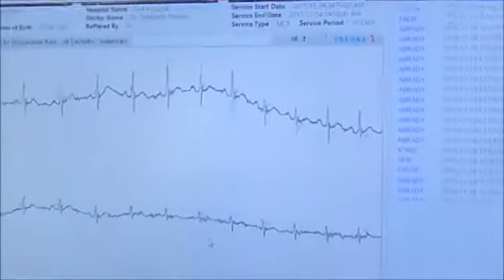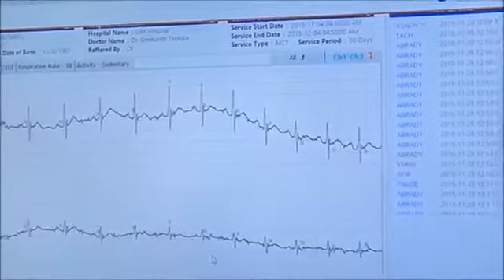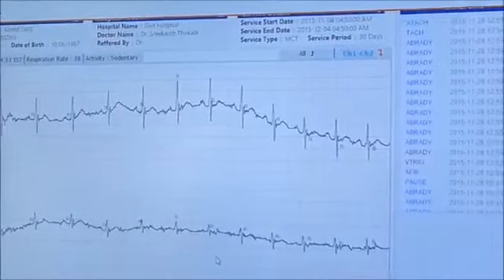There will be minor motion artifacts that will come because of the skin movement. If the person is lying, then it will be very smooth. If the person is moving, then because of skin stretching, minor motion artifacts will come.